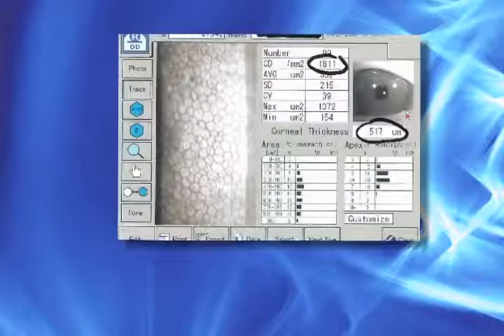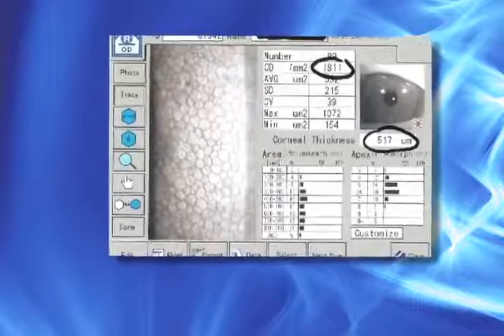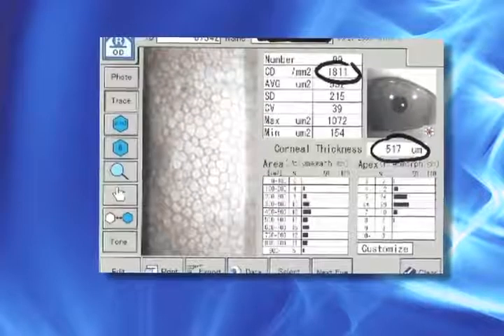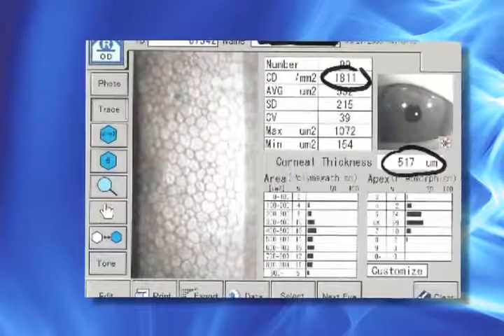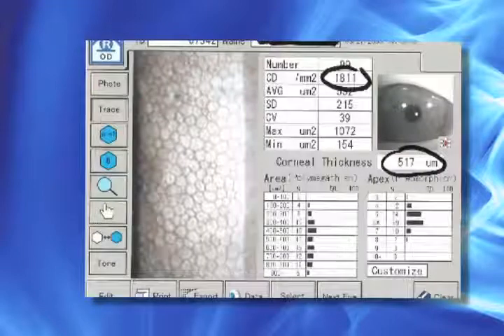There's something else about the cornea that we have to check as well, something called the endothelial cell count. What you're looking at now is a photograph which magnifies the inside membrane of the cornea. The cornea, of course, is the window to the eye, that front clear membrane. The number of cells on the inside of the cornea, these are called the endothelial cells, is fixed at birth. We lose them slowly as we grow older. Some people aren't given enough to begin with.